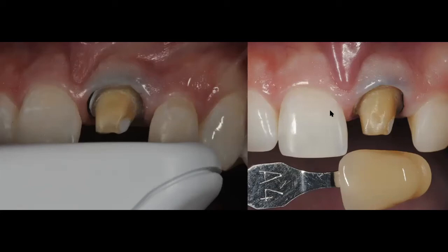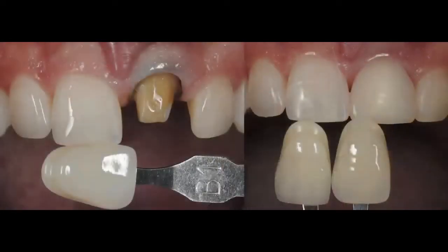So it was a very light tooth. And now I have to match this. I've got to obtain a ceramic restoration with no metal underneath. So just a glass ceramic or a zirconia type of restoration that can hide this shade, this stump shade, and at the same time reproduce what we have on this neighboring tooth. So that's a very difficult task for the lab and for us.